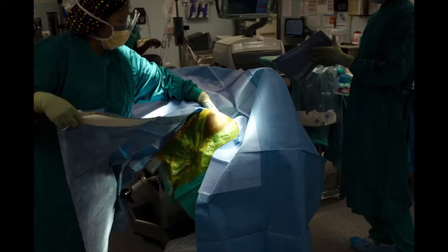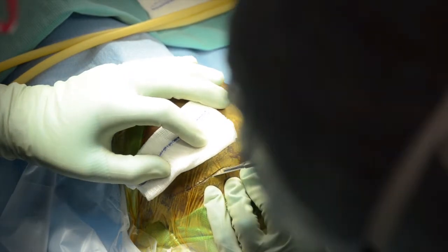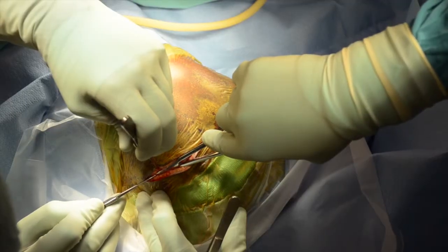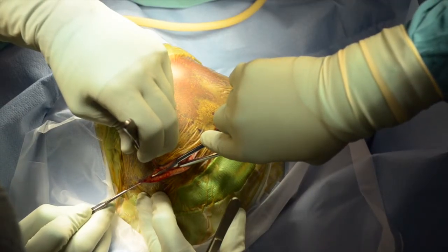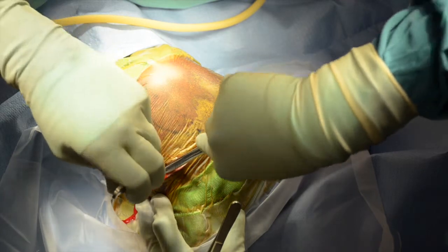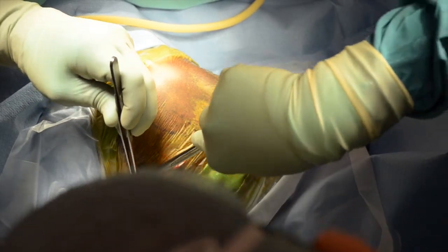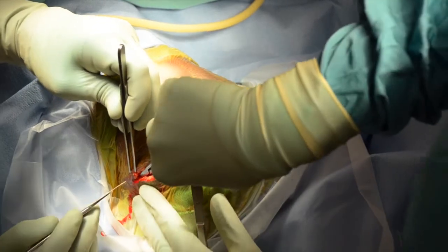The surgical field is then prepped and draped in the usual fashion, including sterile towels, Ioban, and a craniotomy drape. The forehead down to the eyebrows must be included in the surgical field. A linear incision is made from superior temporal line to superior temporal line. If pericranium is being harvested, care must be taken not to cut through this layer and to stay just deep to the galea. Raney clips are placed to reduce scalp bleeding.